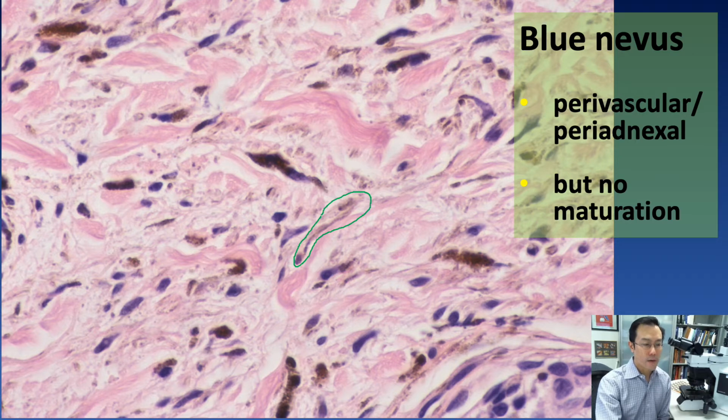but as a matter of practicality, we never attempt to actually figure out on a cell-to-cell basis what is a melanophage and what is a melanocyte. Sometimes the cells will have more or less distinctive features, but in general, the very slender dendritic cells are most likely melanocytes, and the more enlarged, round to ovoid cells are more likely to be melanophages.